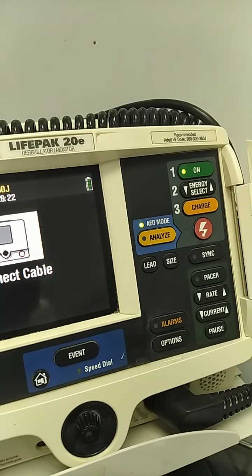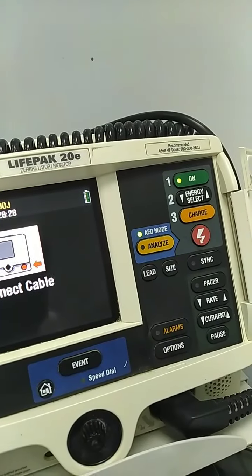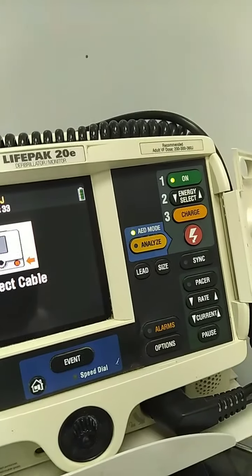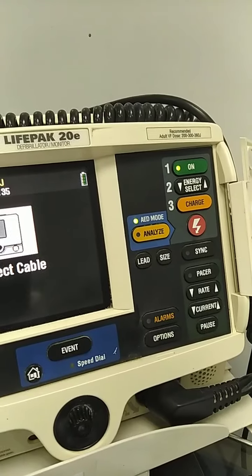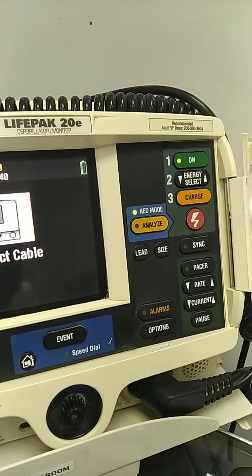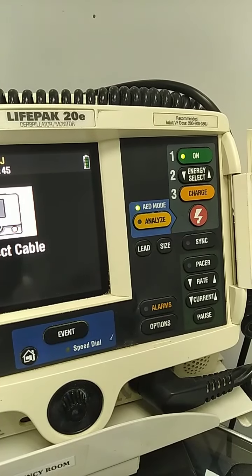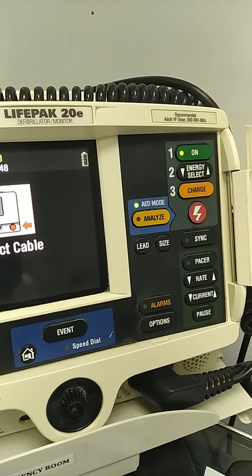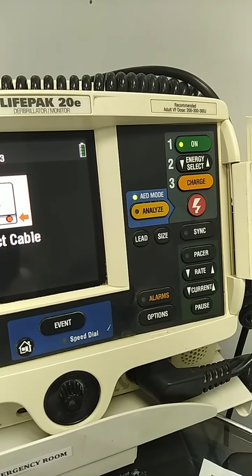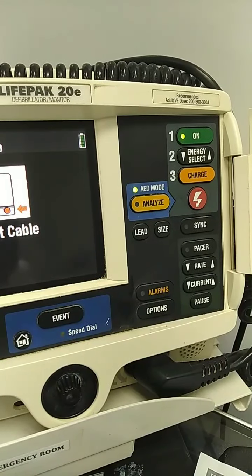With cardioversion, our patient will have a pulse, so we're going to sync. Here's your sync button. We will press the sync button. This will track where the R waves are, so we don't shock the patient during ventricular repolarization. We will choose the energy, and go ahead and charge. So do your safety measures. I am clear, you are clear, everyone clear. Make sure the patient has a pulse, check the blood pressure, and hopefully they have converted nicely.